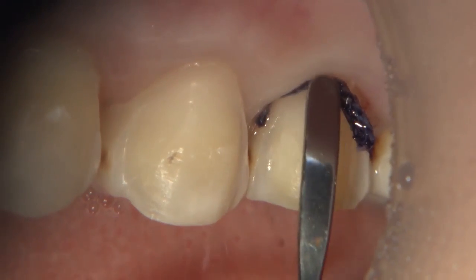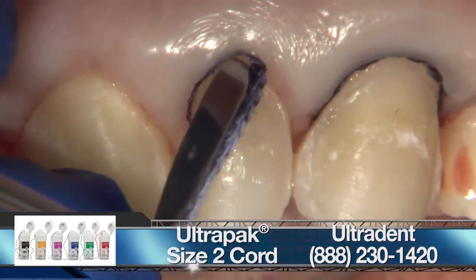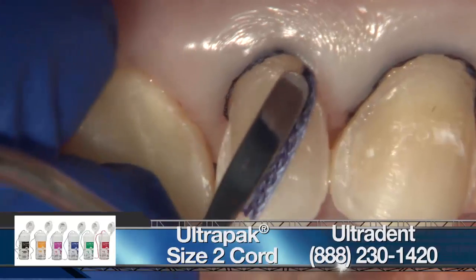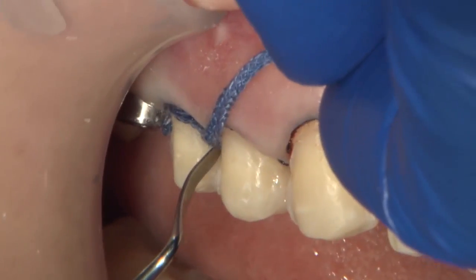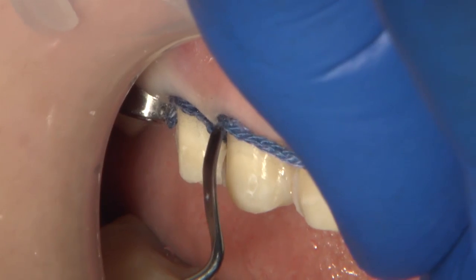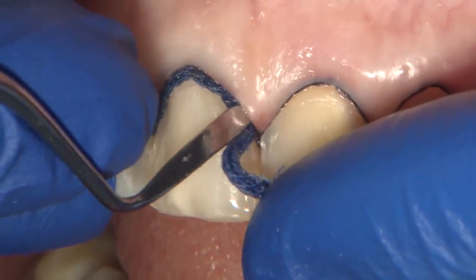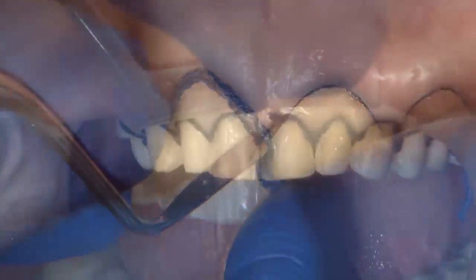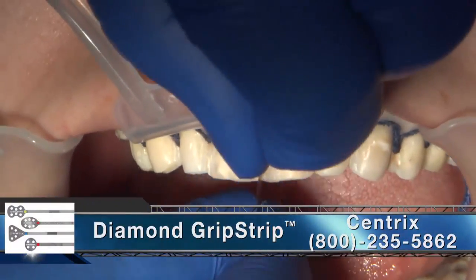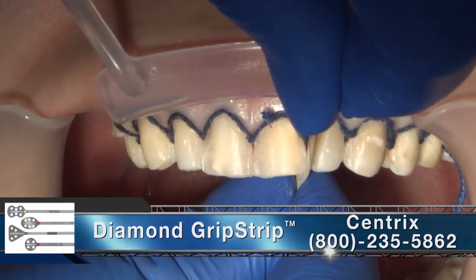Using a double cord technique to expose the tooth apically will definitely aid the technician in seeing the tooth below the margin, so that the technician will have a better idea on how to contour the margin and blend the obsidian material into the existing tooth contour. Before taking the final impression, I used grip strip to carefully separate the interproximals so that the technician could see the margins.